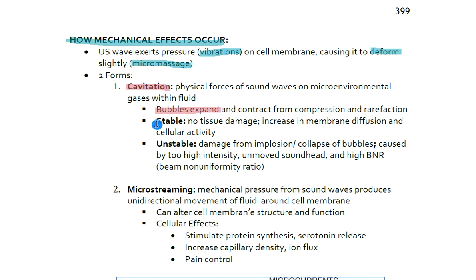Ultrasound causes these small cavitations, because you have to remember ultrasound is delivered at 1 to 3 megahertz, or 1 to 3 million cycles per second. So it's a very fast speed. In 1 minute, if it's at 1 megahertz, you're talking about 60 million sound waves penetrating that tissue in a minute. So that's quite significant.